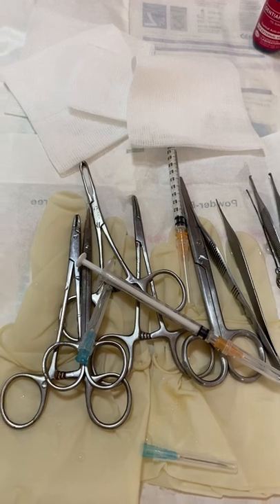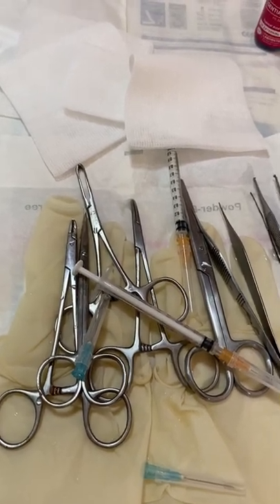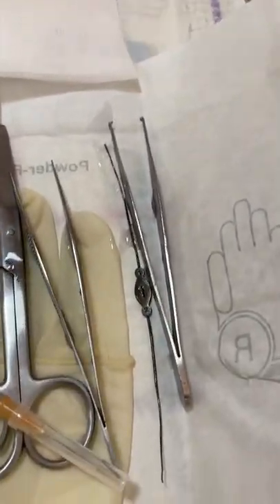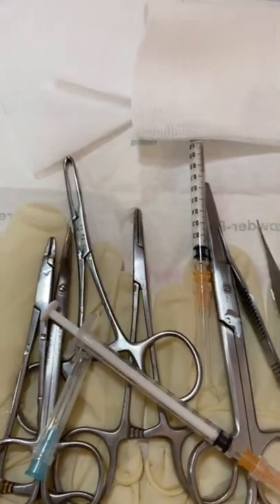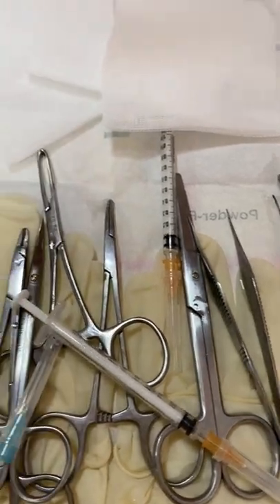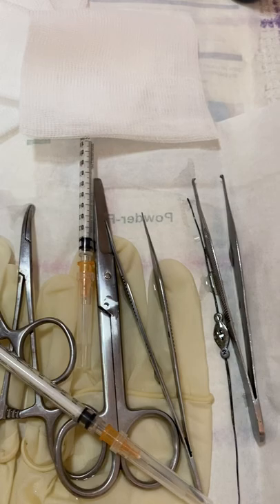These are the instruments I have prepared. We need gentian violet, a probe, and of course local anesthetic because we are doing it inside the clinic — it's not in the operating room.